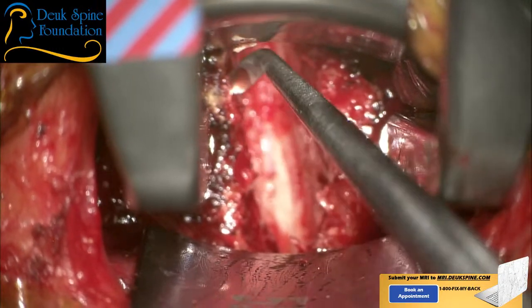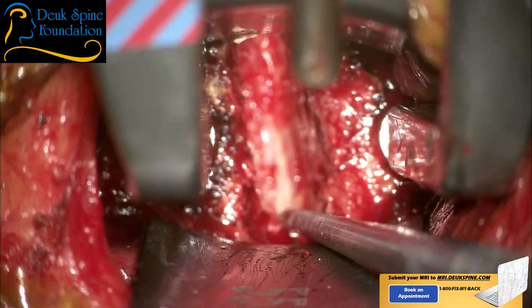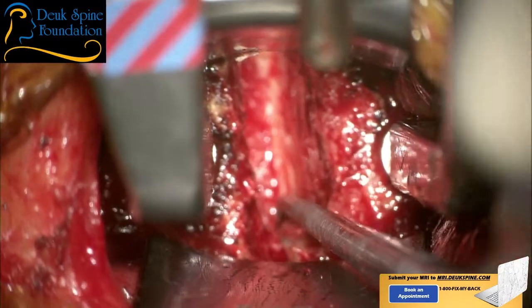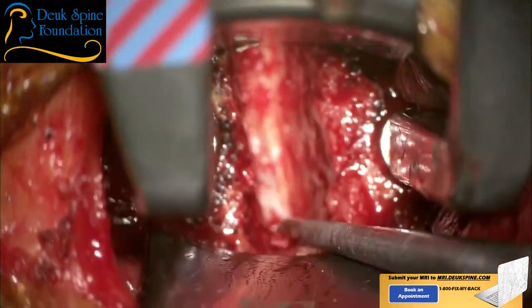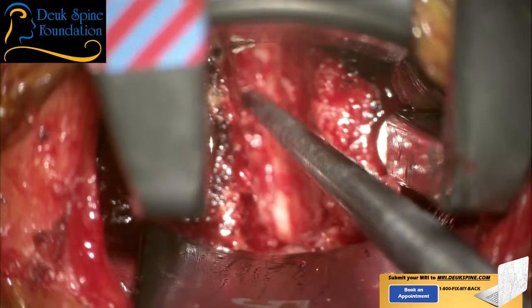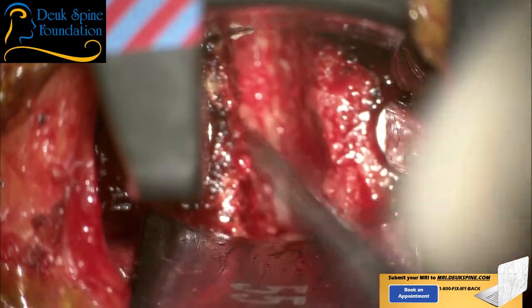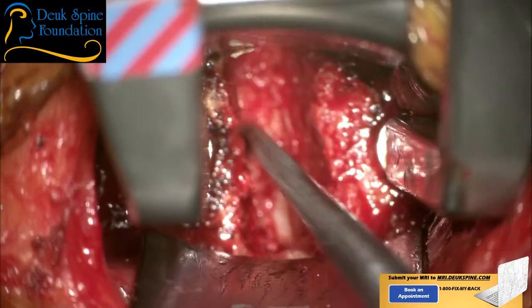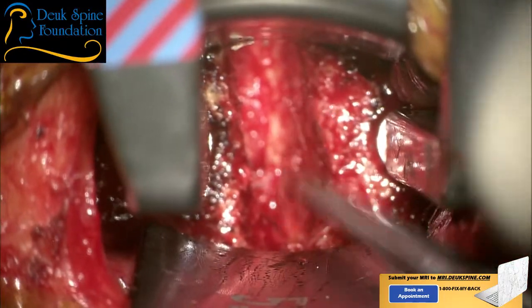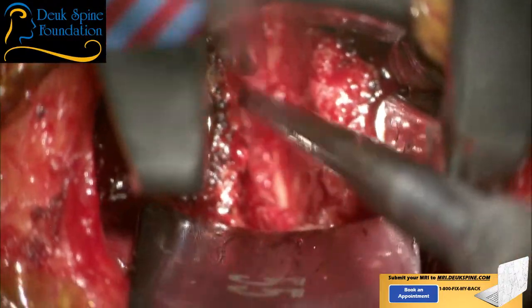All right, so this was the front of the disc here. Remember, it was ripped off of the bottom of the bone from trauma, and now 90% of the disc is gone. It was sitting in here. And it's because of this technique that all these surgeons do, where they have to remove the front of the disc to get to the back here, where the herniation's pushing on the spinal cord. Because of this, you have to put something in this space afterwards, like a cage, and do a fusion. Because we don't take the disc out with the Deuk laser disc repair, you don't have to do any fusion or put any metal or anything in here, okay?